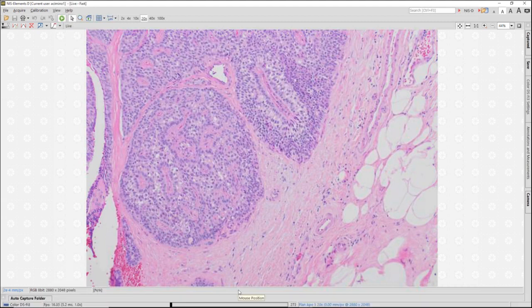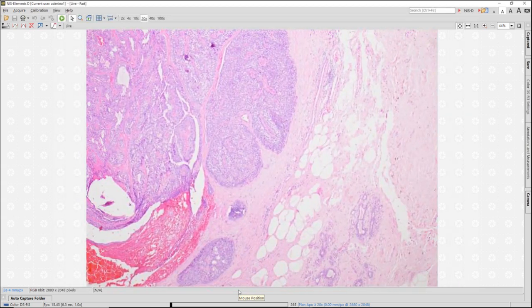The differential in these is often lobular neoplasia, if you have ALH or LCIS involving a papilloma, because the myoepithelial cells can frequently show this cleared out cytoplasm, but all of these cells show intact membranous E-cadherin labeling and label for myoepithelial cell markers like P63 and calponin. All right, so those are the benign intraductal papillomas and the benign papilloma variants that I want to mention right now.